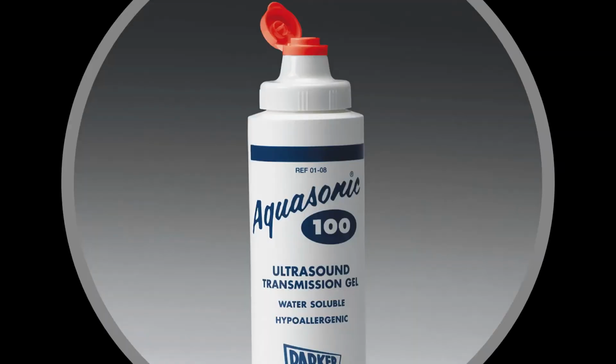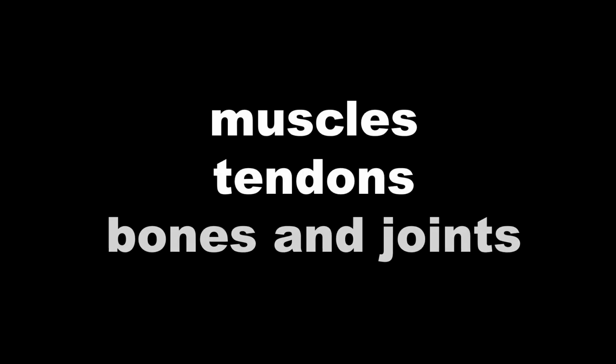And then last, and I've said this throughout the year, you absolutely need to be using a lot of gel. When you're ultrasounding bones and joints and tendons, there's often a lot of divots, so using a lot of gel will create a medium between the patient's skin and your ultrasound probe so that you don't lose contact with the patient. We'll jump into what some of this looks like now. We'll start with muscle, then we'll look at tendons, and then last, bones and joints.